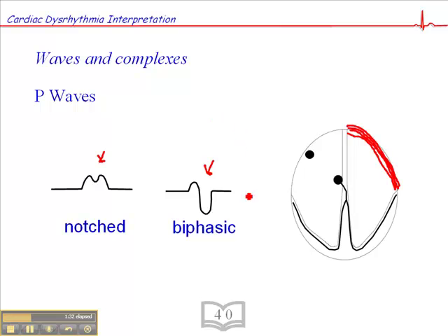And so consequently there's more waves or energy flowing through that left atria, and it alters the P-Wave morphology. So if you saw notched P-Waves consistently preceding each QRS and the rhythm was regular, this would still be a sinus rhythm.